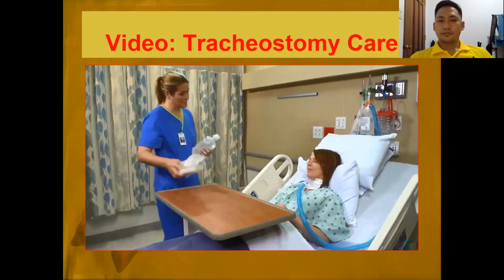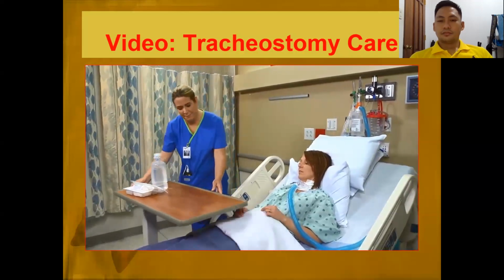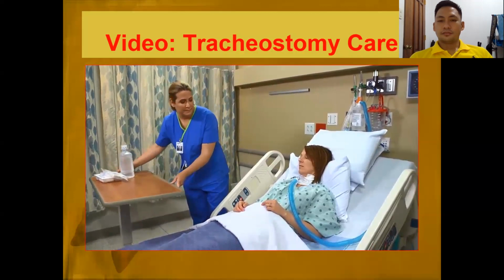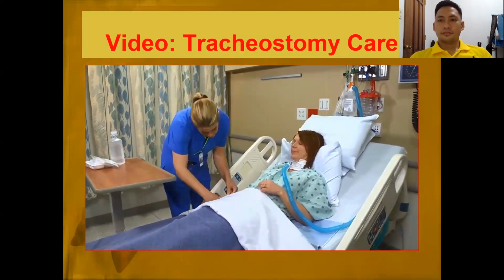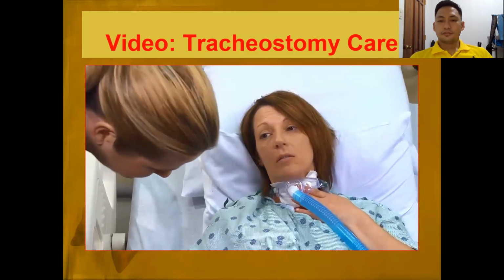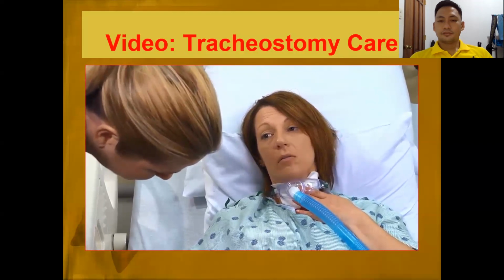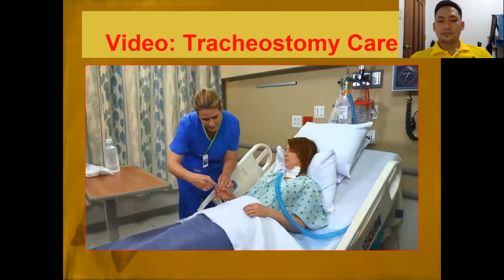Good morning. My name's Erin. I'll be the nurse taking care of you today. Then identify her using 2 identifiers. Can you go ahead and tell me your full name and date of birth? Carolyn Lance, 3672. Begin your care by clipping a pulse oximeter to the patient's index finger.